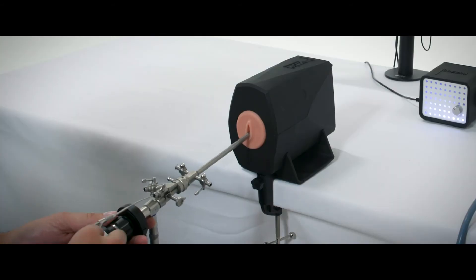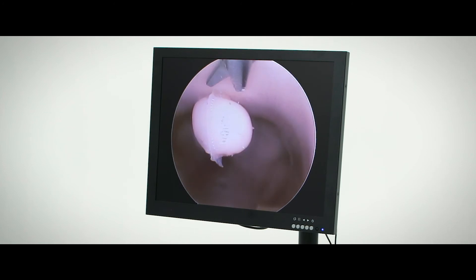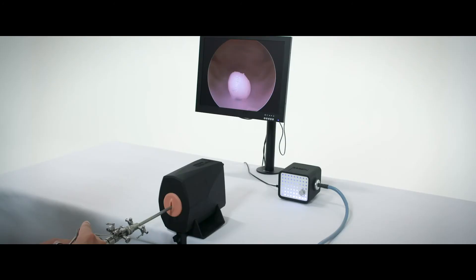We can use the hysteroscopic scissors to dissect out our polyp, and once that's performed we can pop the used polyp out through the side of the uterus through one of the holes and place the next polyp in for the next user to carry out their simulation.